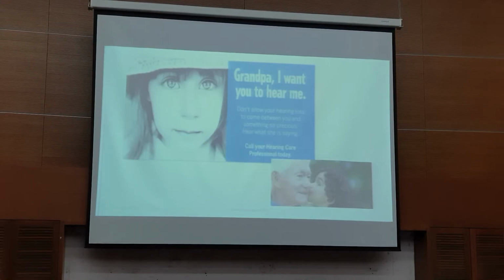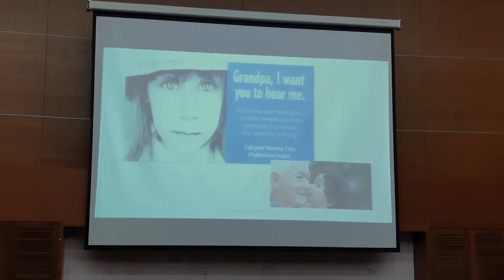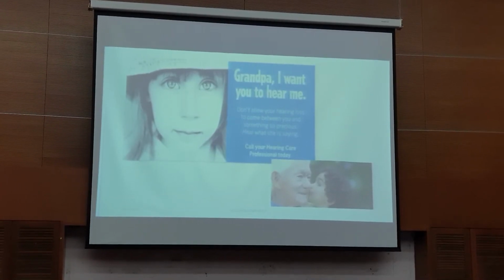Probably I should make it clearer. My question is, what's the aim of fitting a child and also an adult? For speech development. That's for a child. All right. And for adults, for communication.